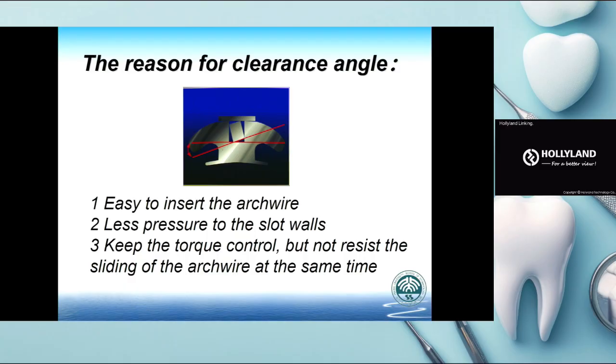What's the reason for clearance angle? First, it's easy to insert the arch wire, which is also very important. Second, you get less pressure on the slot walls. That means you get less friction. Third, you can keep the torque control without resisting the sliding of the arch wire at the same time. So that's why a full-size arch wire is not always the good way.